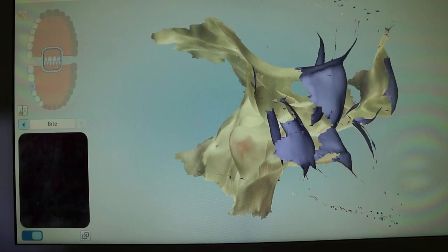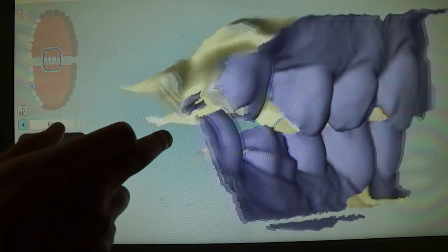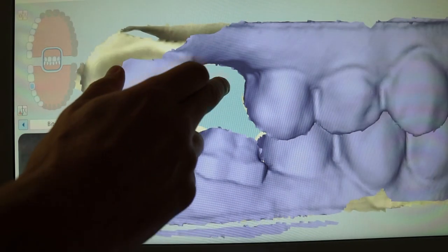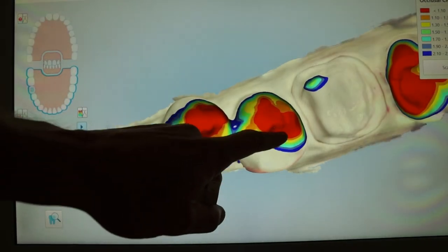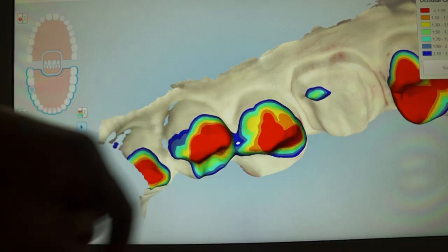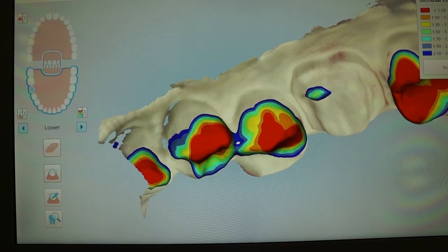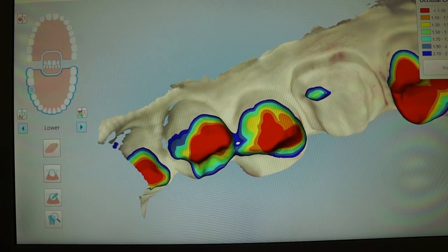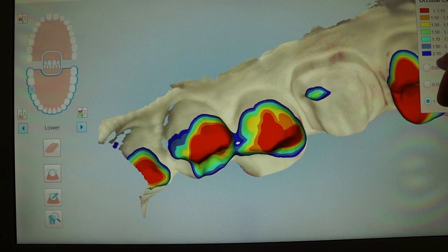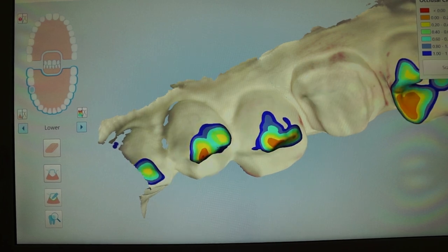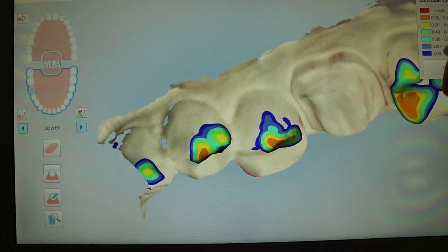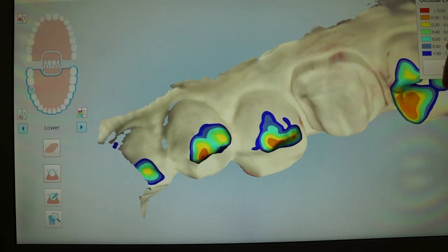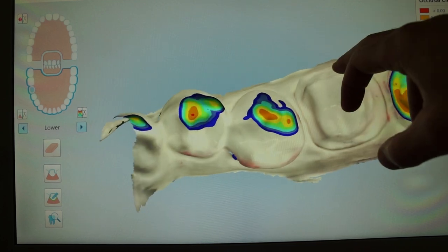In this case, the occlusion wasn't that important, but nevertheless, you want to make sure you have all your information complete. iTero gives you this nice kind of color-coded map as far as distance between your prep and the antagonist, and you can change the scale of that.